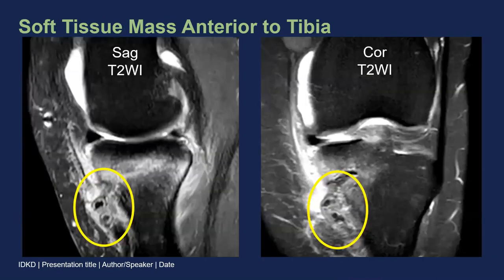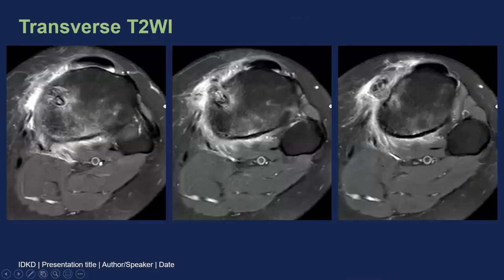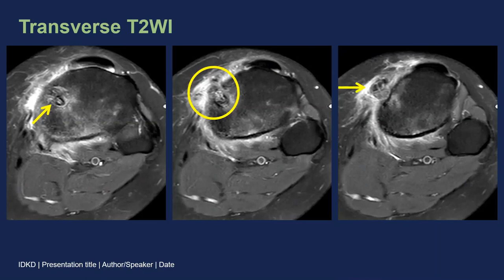Now we can go back and diagnose our patient. One of the findings was a soft tissue mass anterior to the tibia containing some sort of foreign material. On T2-weighted images, we can see part of the interference screw is sitting within the tunnel and the tunnel looks normal, but where it exits the anterior cortex of the tibia, there is an inflammatory mass anteriorly surrounding fragments of the bioabsorbable screw. This is called a pre-tibial cyst.